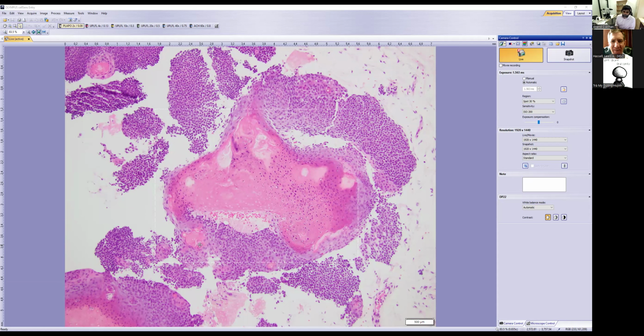The skin excision and the axillary tail were taken out. I don't have a picture of that, but essentially, on the resection specimen, we could see that this was extending focally to the epidermis and was entirely based out of dermis.